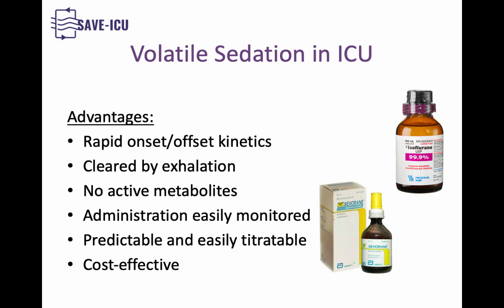You usually run an IV infusion to clinical endpoints, but a lot of times these patients accumulate these medications in their body and their concentrations rapidly escalate. And when you stop these medications, it takes days for them to wake up. Whereas with inhalational agents, you have a real-time end-tidal monitor that tells you what concentration the brain is actually seeing in real time.